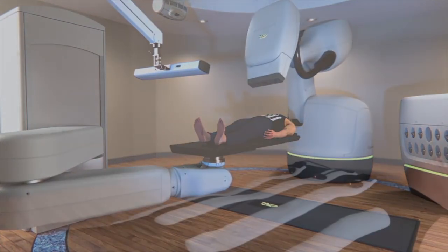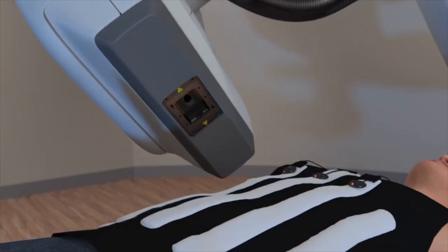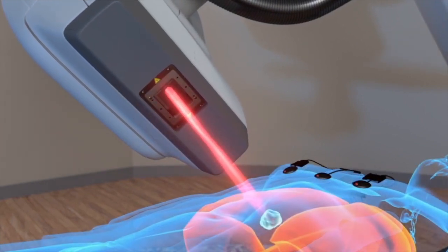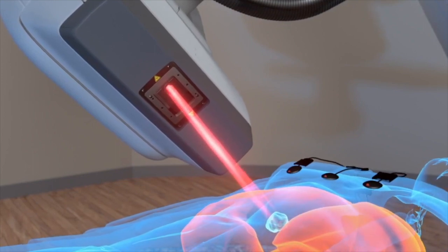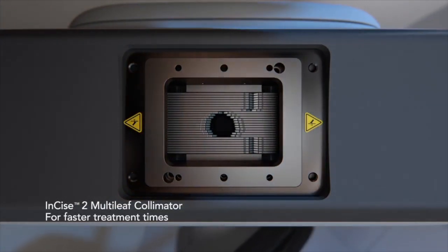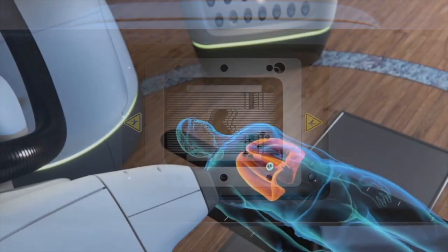The Synchrony Respiratory Tracking System tracks and corrects to the moving tumor with submillimeter precision as the patient breathes normally, avoiding healthy tissue. The Incise multi-leaf collimator shapes the beams to efficiently and precisely deliver the treatment.